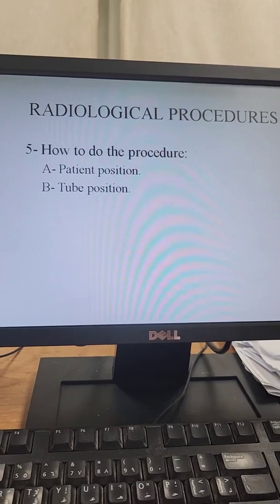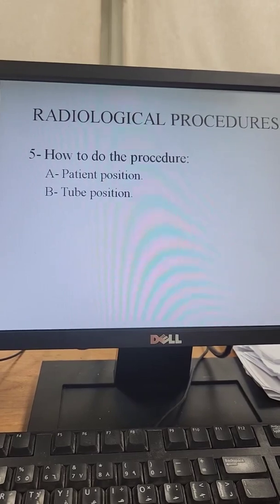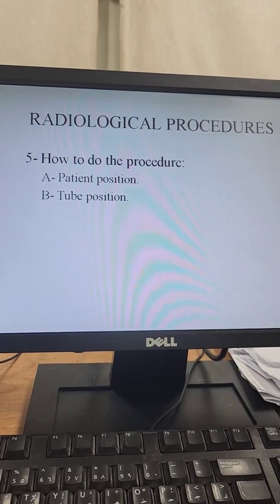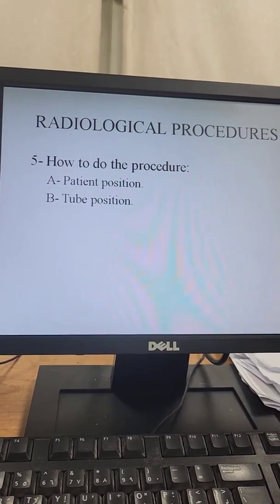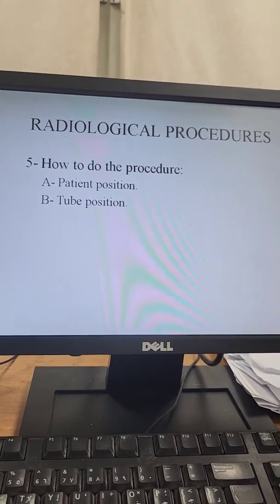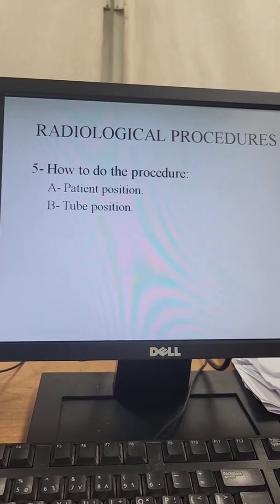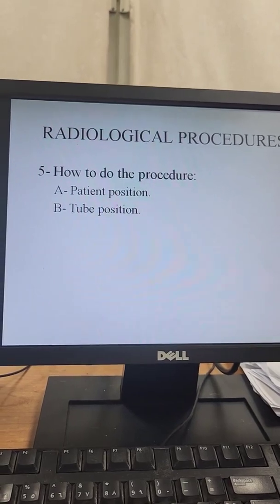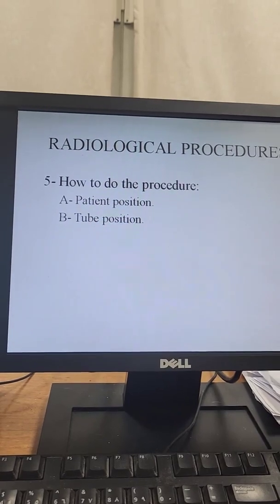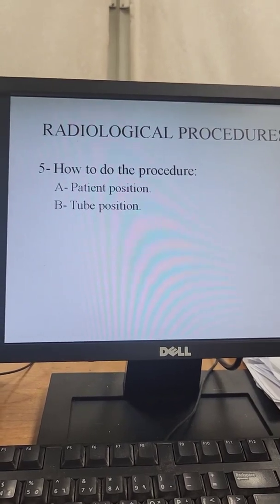So this needs some experience to adjust the contrast media to reach and start the examination immediately at this timing. And the dose of contrast media also should be adjusted, not too much, because we need the contrast media only in the pulmonary circulation, not in the superior vena cava and not in the left side of the heart. Okay, so 30 to 40 ml of contrast media are quite sufficient with the new machines to do the procedure.